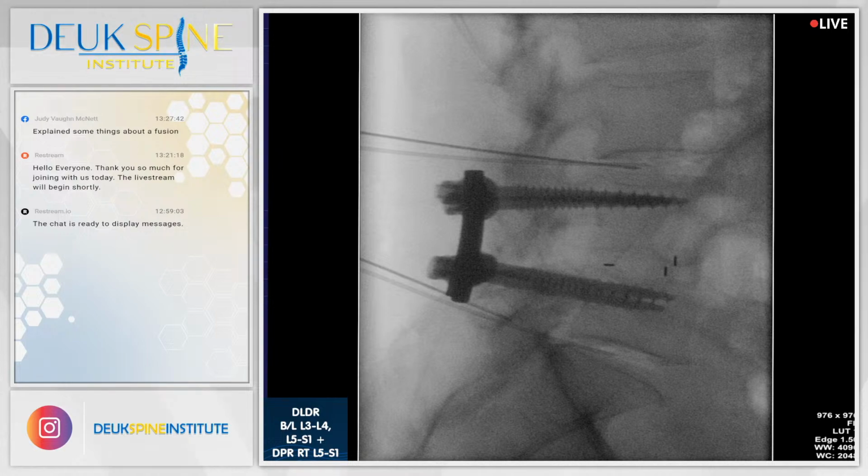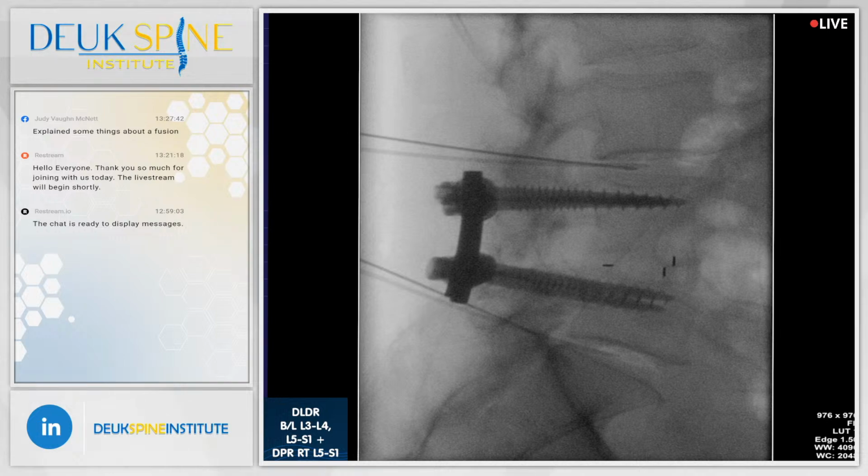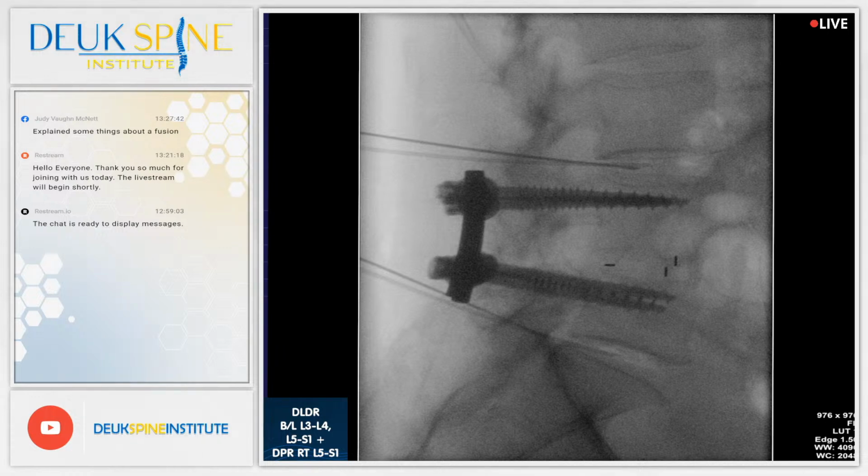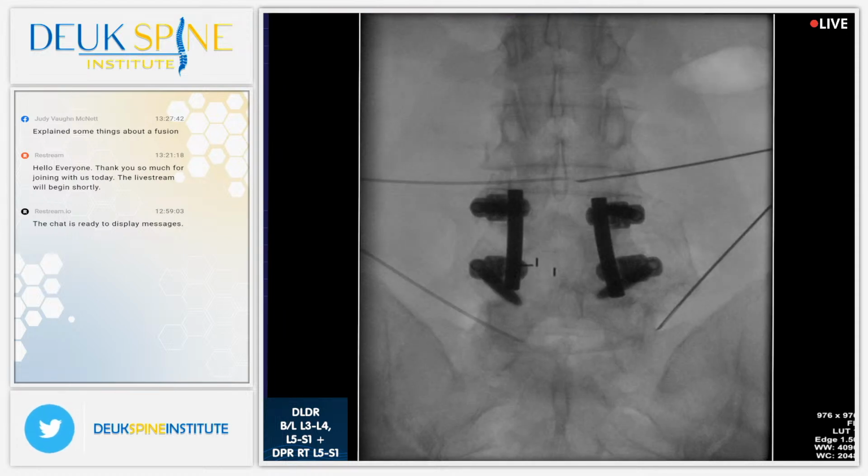I think I might have it. Let's see. Oh yeah. As I said, it's better to be lucky than good. Shot. Let's see if we're there. Give me an AP. Yeah, we're awfully close.